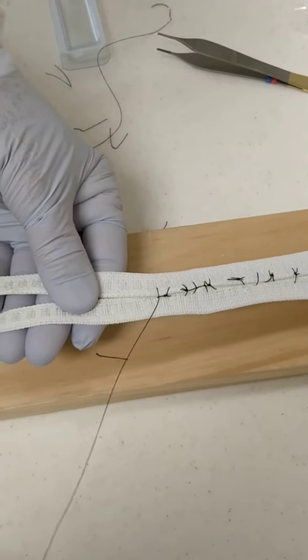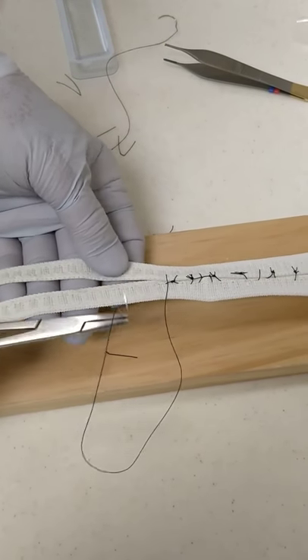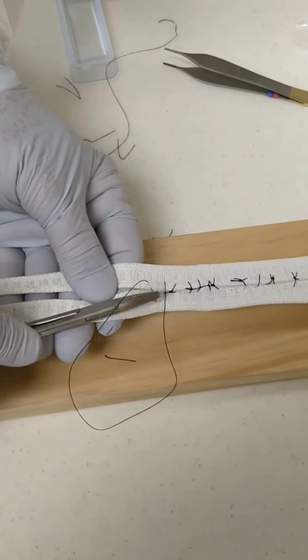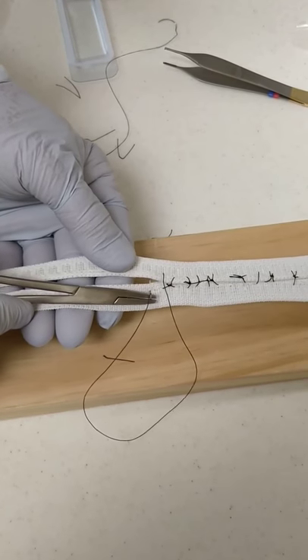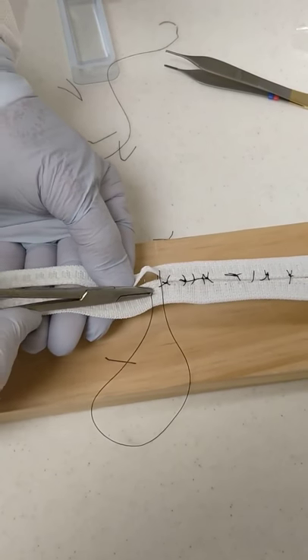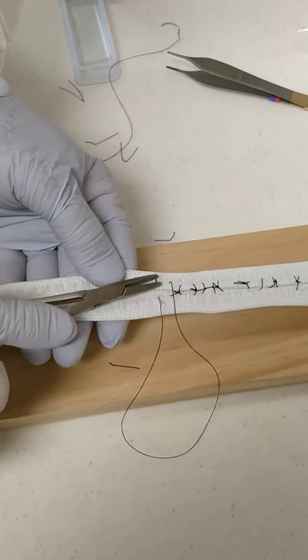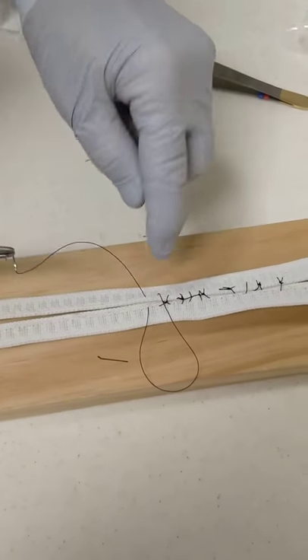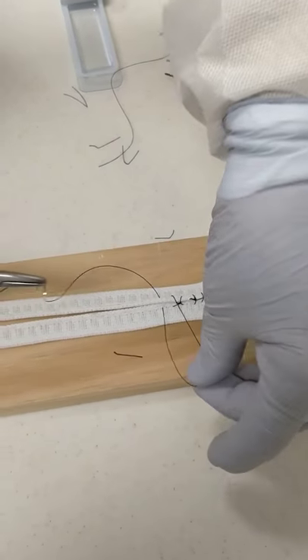The problem with this is once you let off your tension, and you go to pass your next suture, it will sometimes unravel. We don't have that problem on our suture boards so much, but you can see that it is starting to unravel.